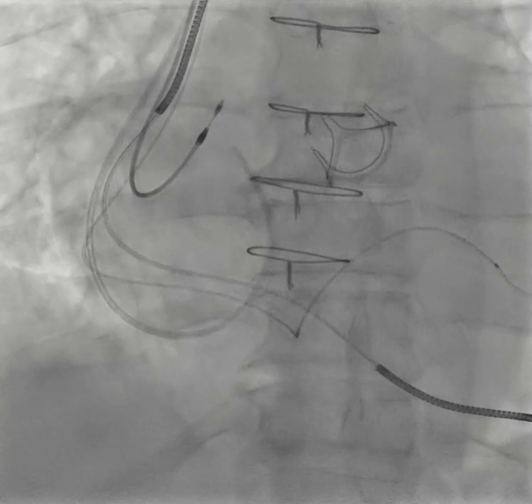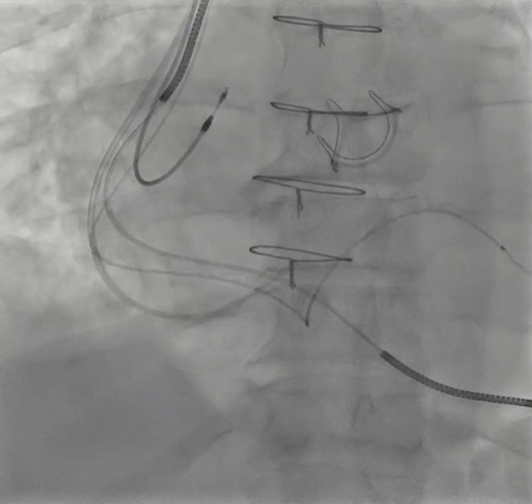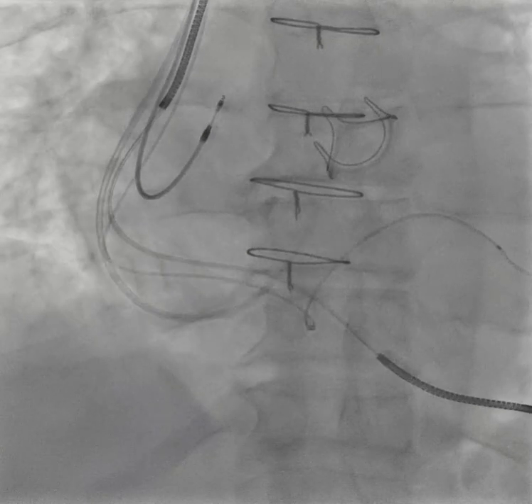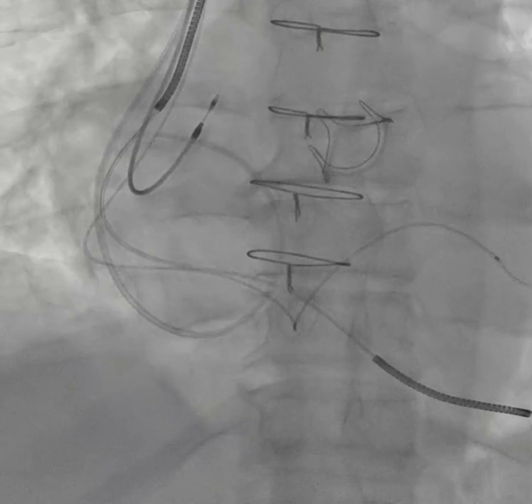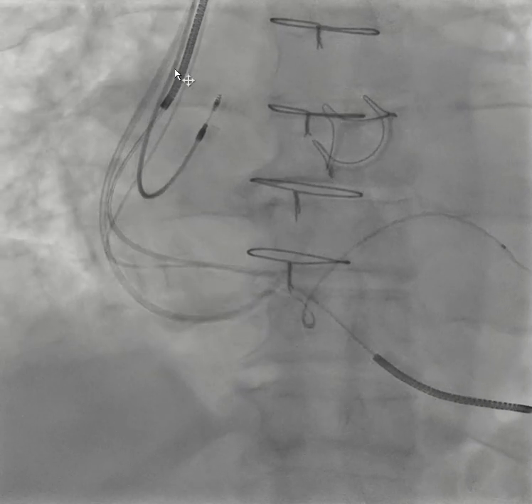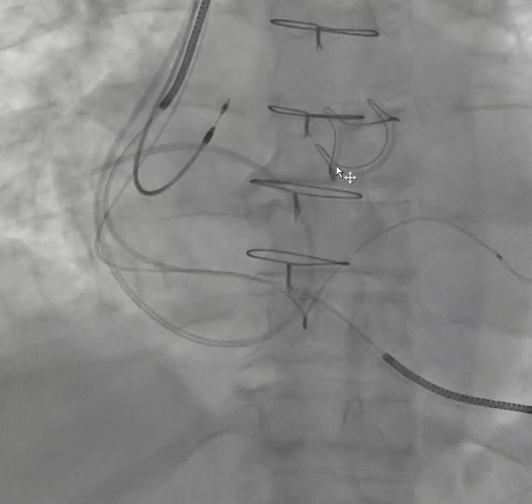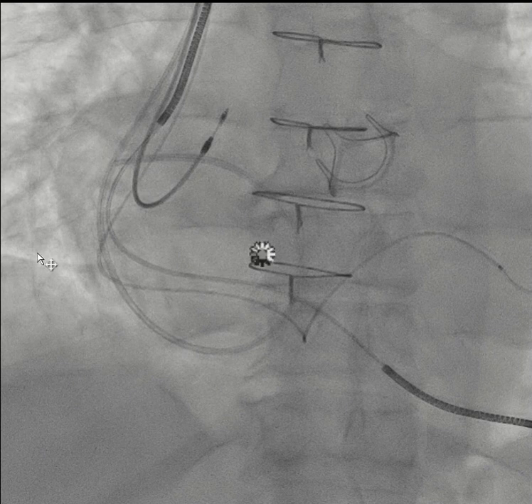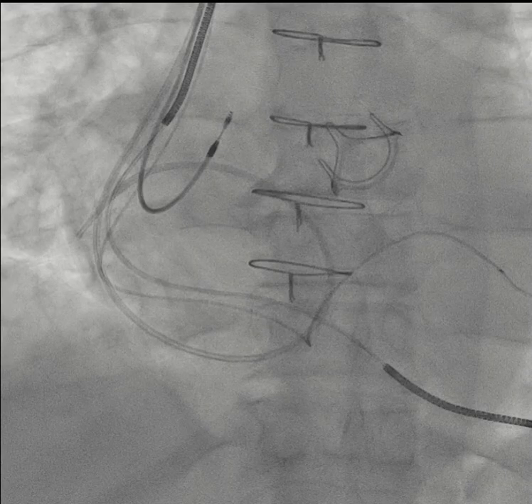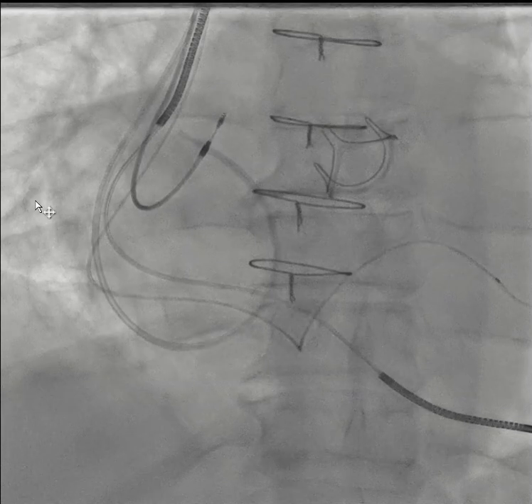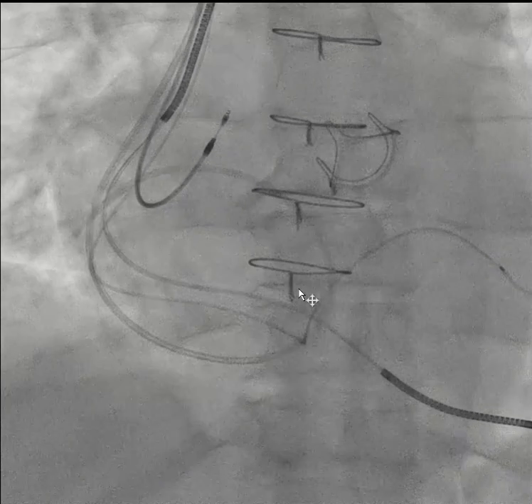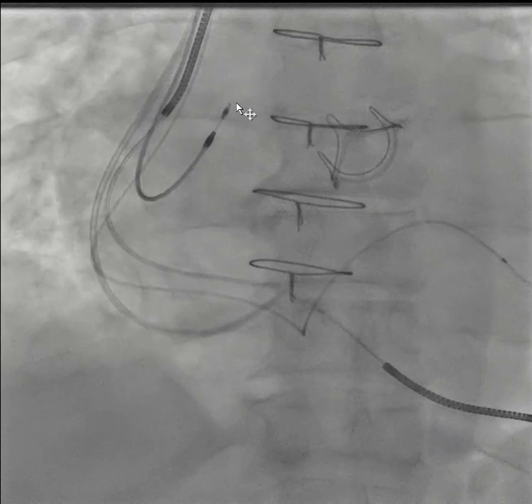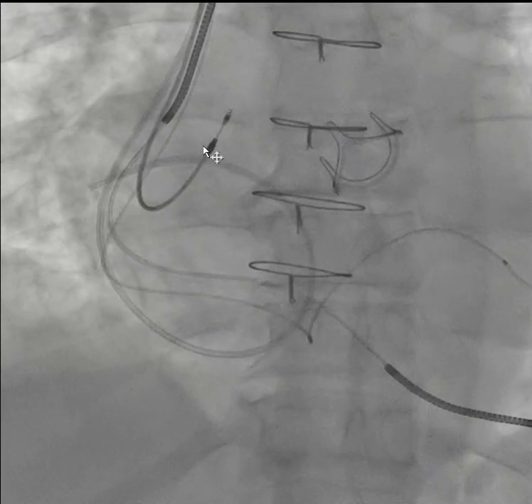This is a case of a patient with cardiomyopathy where the right heart catheterization is being performed through the right IJ axis. As you can see, the right atrium is huge and the catheter is curling up in the right atrium. This could be a problem — you don't want to push too much because the tip of the catheter may go into the right atrial appendage, as you can see here, and can perforate that.